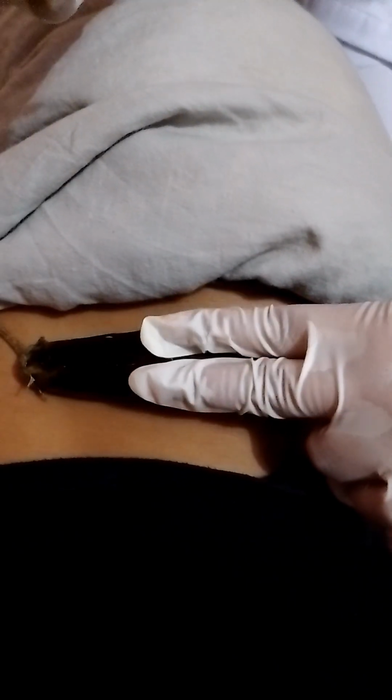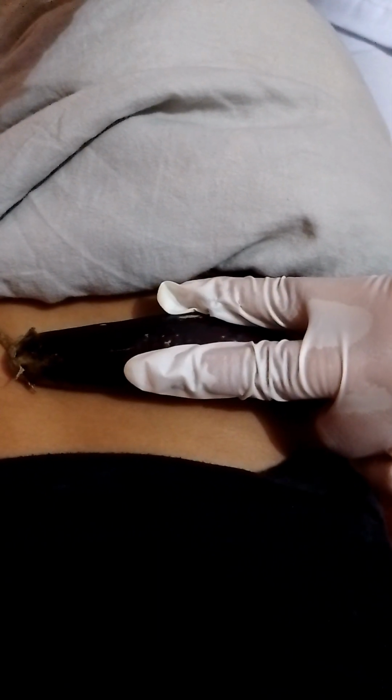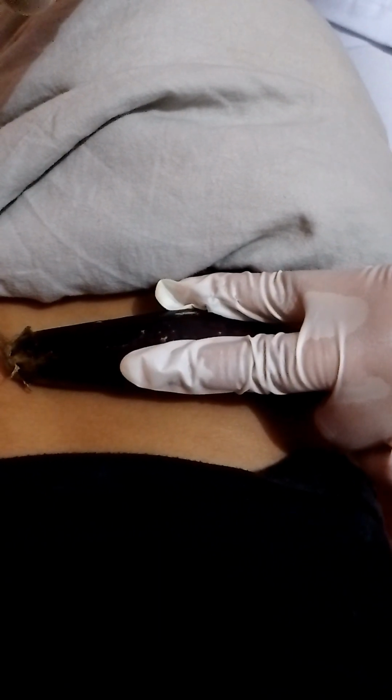And now, pull the skin laterally for about 1 to 1.5 inches. And then aspirate the syringe by pulling the plunger with your dominant hand.